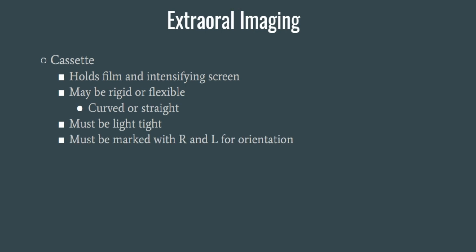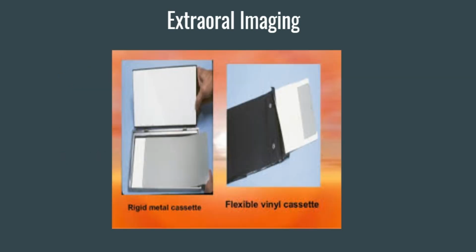Each one will be marked with right and left for orientation purposes. And it could also contain a place to put the patient's name and the date and any other special labeling that the dentist may like to have, such as the dentist name and the location. And this is just an example.